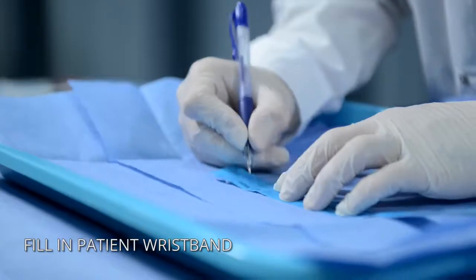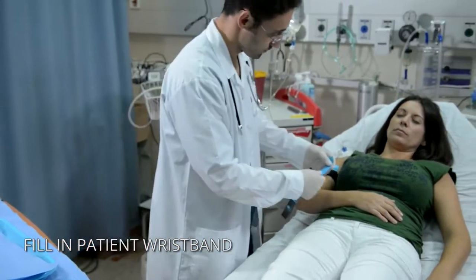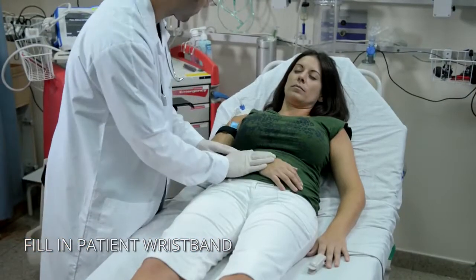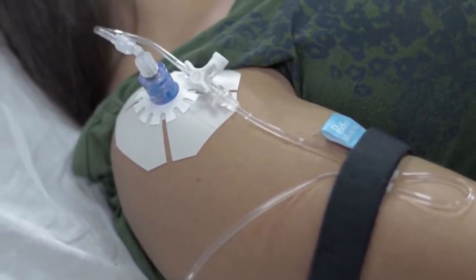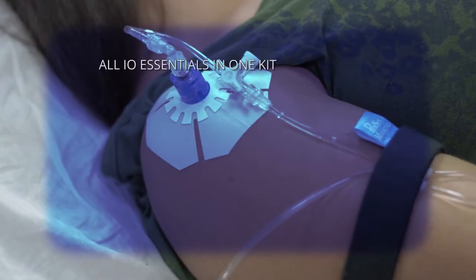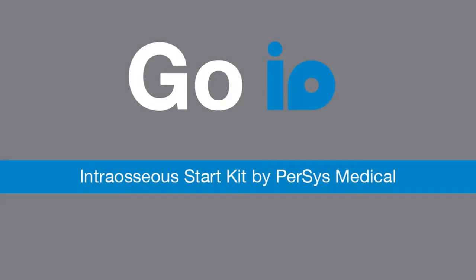End the procedure by filling out the details on the patient wristband and wrapping it around the patient's wrist. Go IO intraosseous start kit by Percy's Medical.